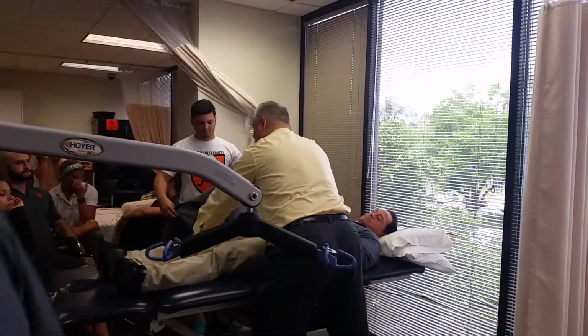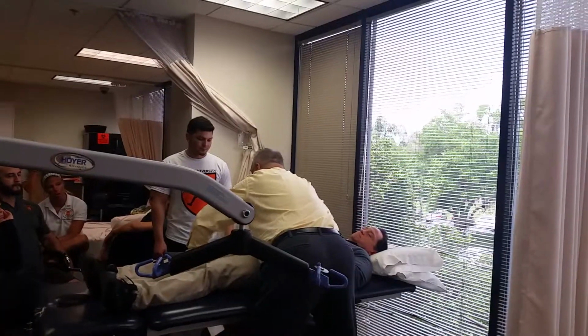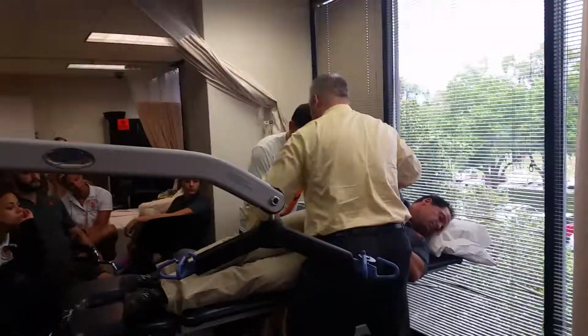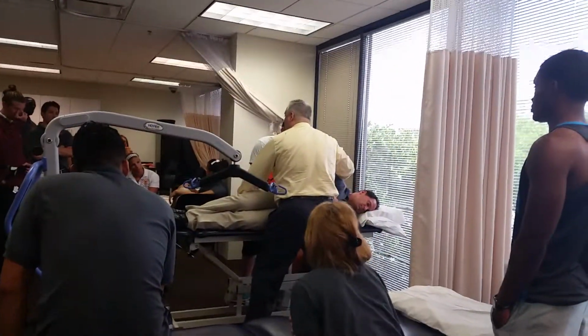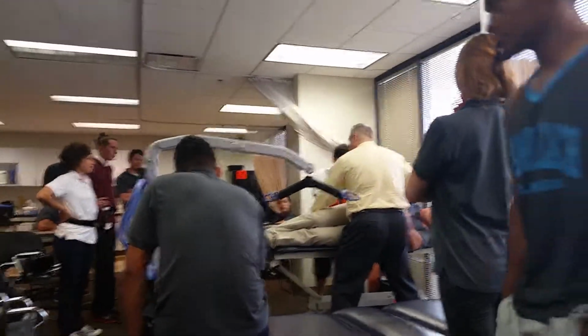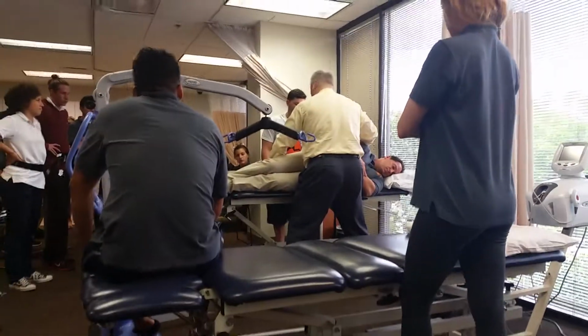Now, I would maybe have a bed sheet that I can use to pull, but for here, I'm just going to roll. So you can see how I'm in here, and I basically roll. So now this is going to allow my partner to get this underneath him. You want to like fold it halfway, kind of stuff. Everybody hear that? We gotta fold this pad so that when he rolls back over, you don't have to pull this, right. Okay, and this is where sometimes OT and PT work together. Okay, or PT and a tech, or nursing tech, or lifting.